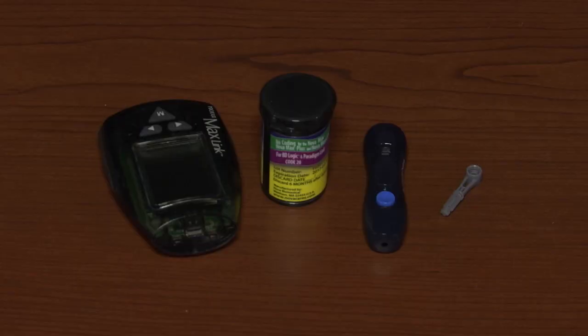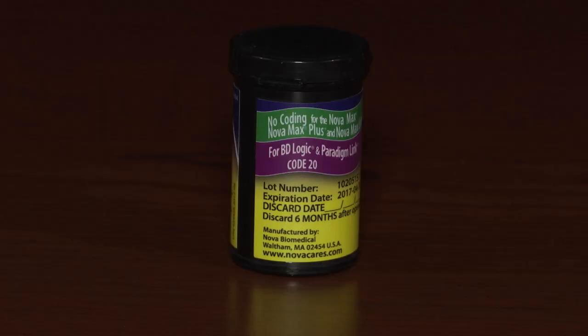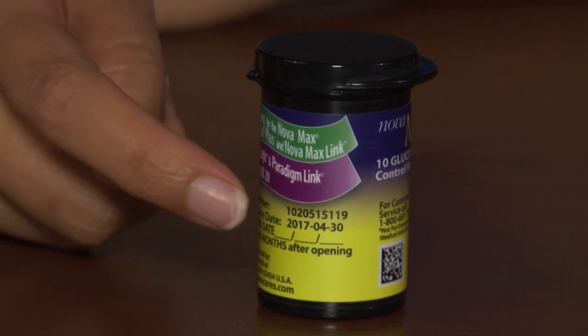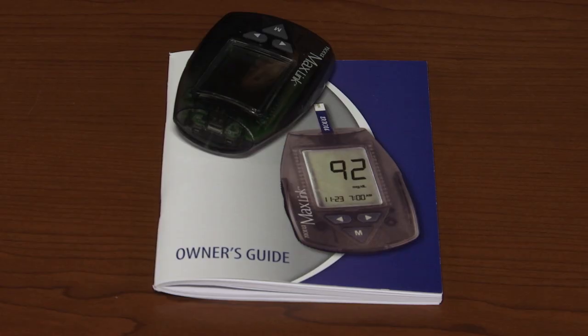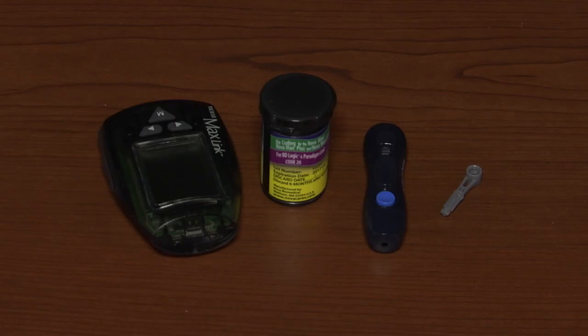To test for ketones in your blood, you will need a blood ketone test meter, blood ketone test strips, and a lancing device and lancet. Make sure to check the expiration date on your test strips. Begin by referring to your meter's manual to properly set up the date and time on your meter, then lay out your supplies.